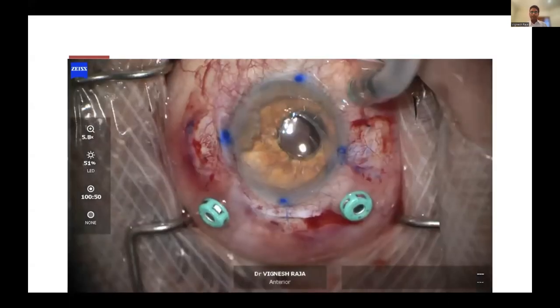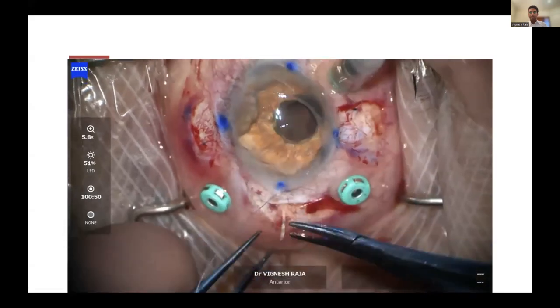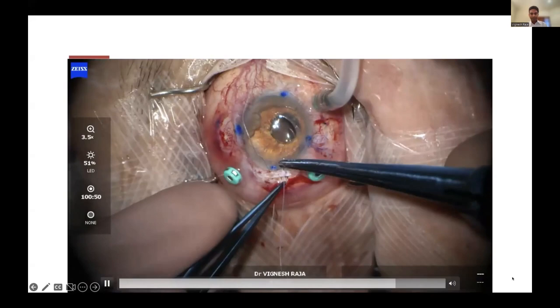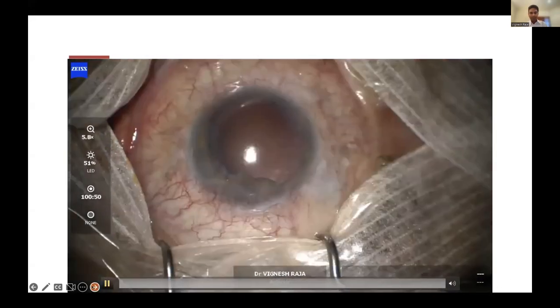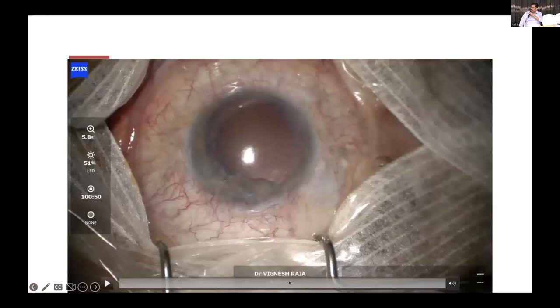And so that's it. This is how the case looks at the end. I just sutured this scleral tunnel because it's quite big. So I secured it with the Yamane on both sides. And that's it from my side. That was terrific. And the first haptic going in maybe would have been a little difficult, is it not? First haptic getting it through the needle?